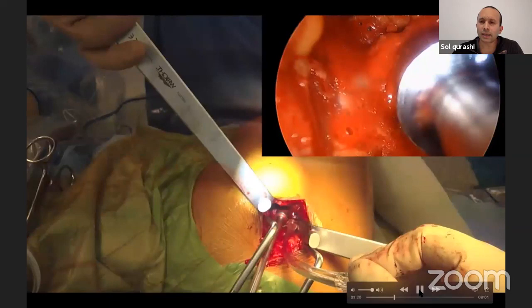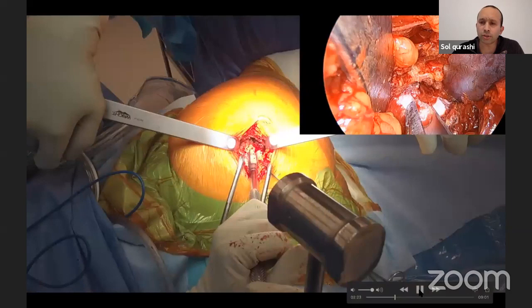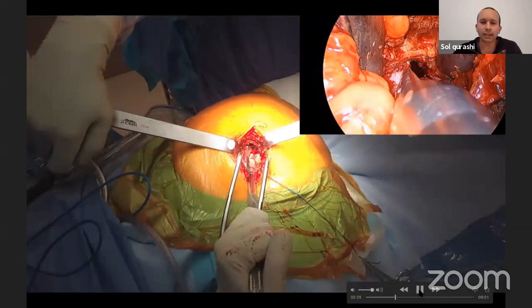And then I'm looking at the canal. So with my box chisel, I'm going to cut out a little hole into the femoral head. And that's the view I get.